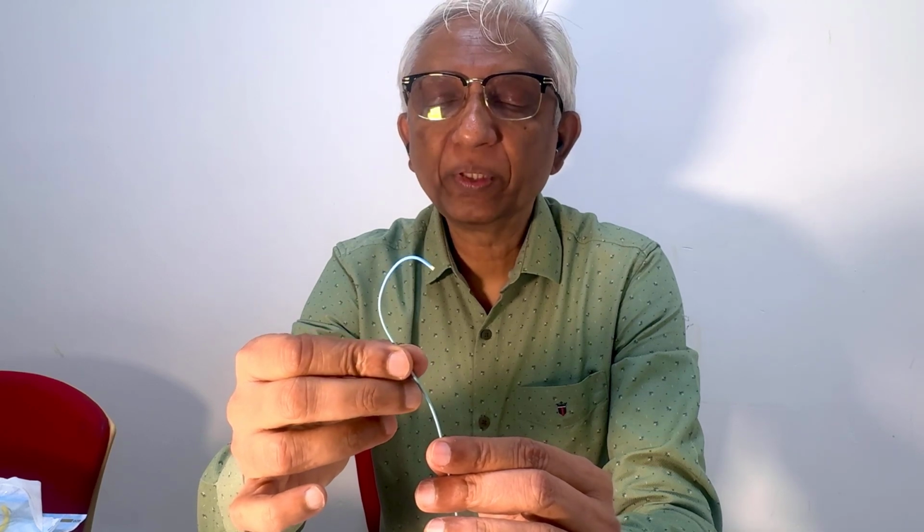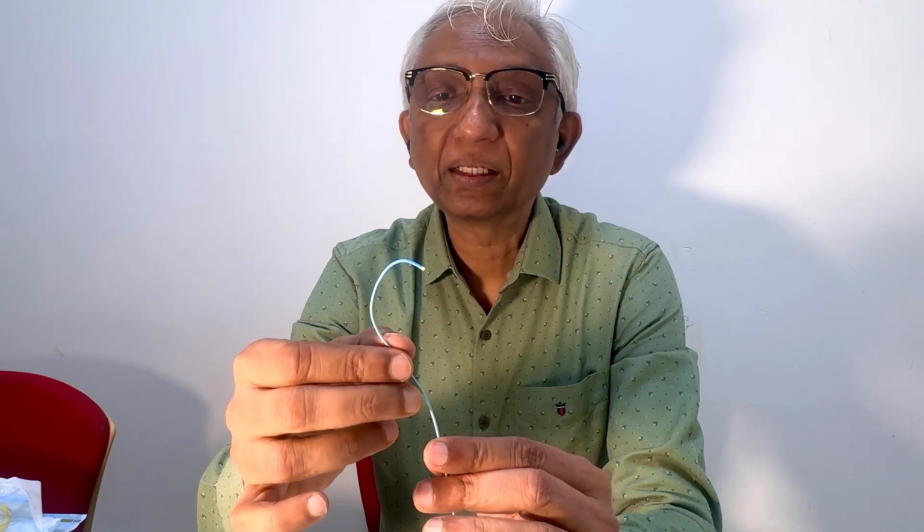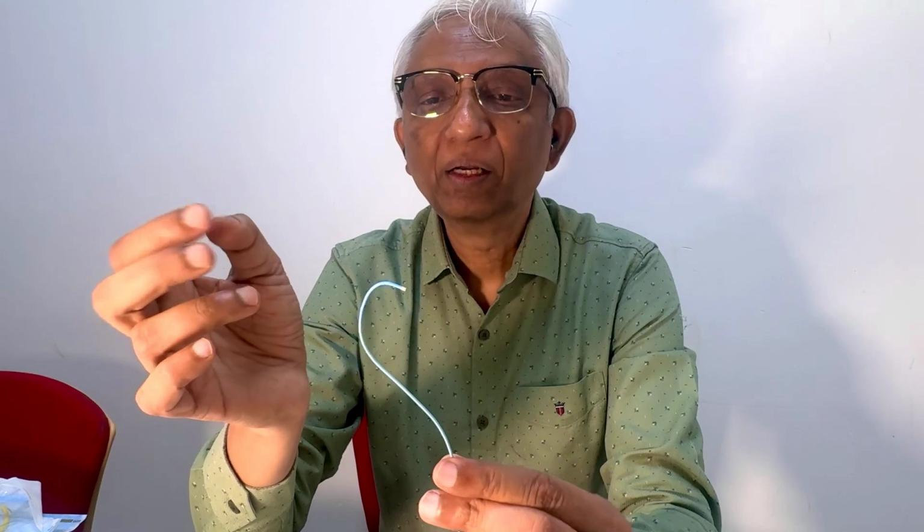So these are visceral catheters, and they work just like the double curve renal. This can be used to enter the renals, the superior mesenteric artery, the inferior mesenteric and the celiac. But the problem is it's difficult to track them beyond it. So it's good for ostial injections, and we'll show how you can go selective with certain catheters. Okay, so this is a Cobra, and I also showed you the Judkins right to make you understand the secondary curve that is there.